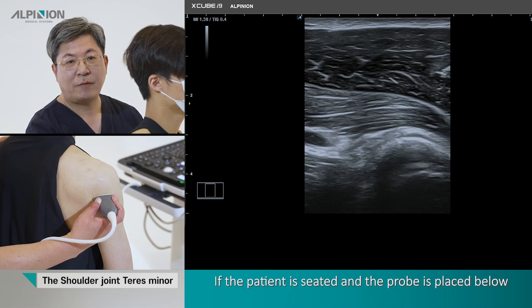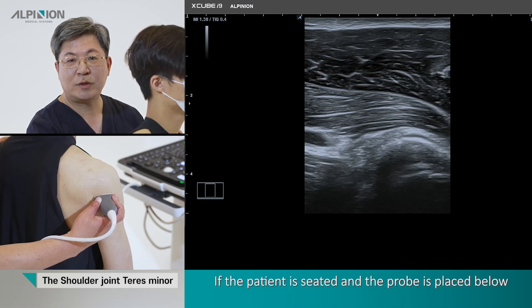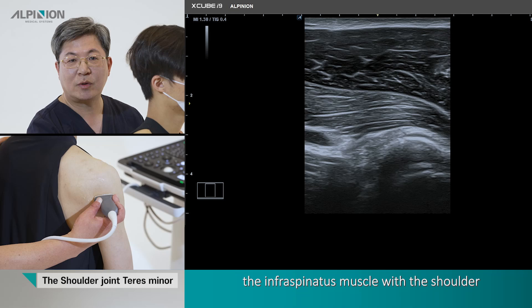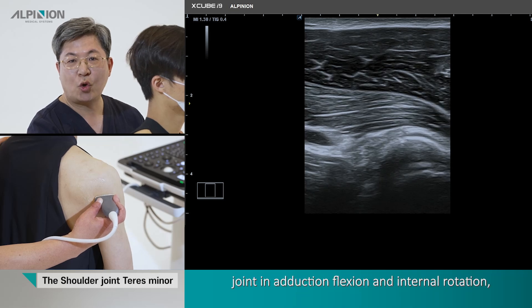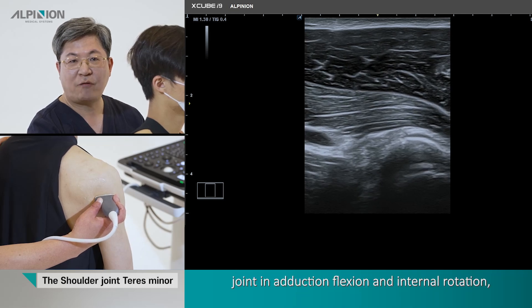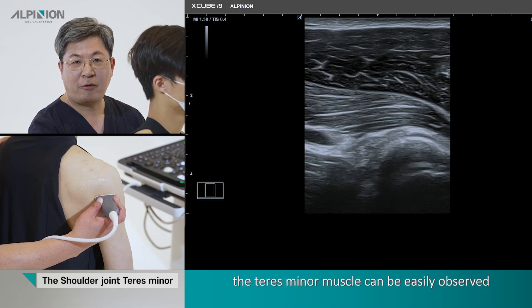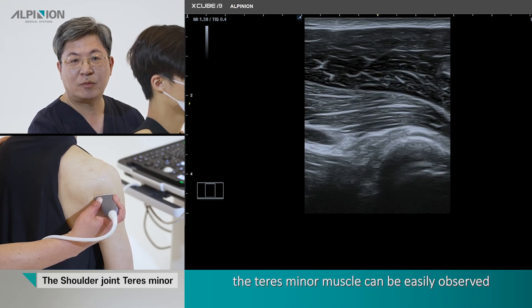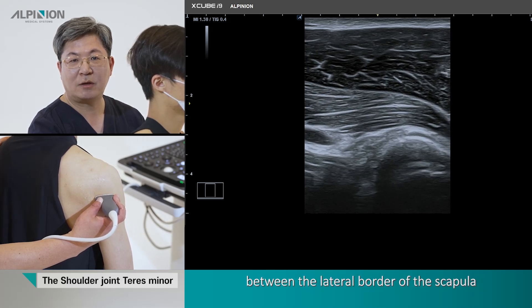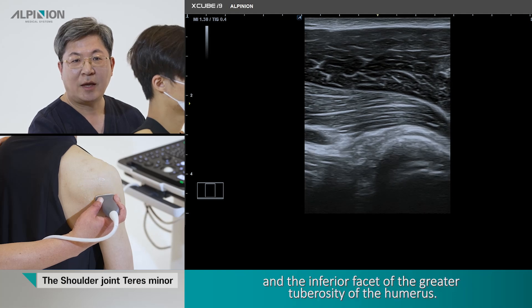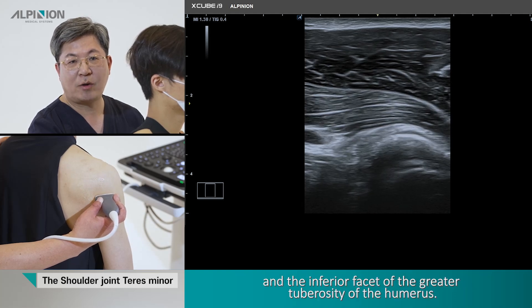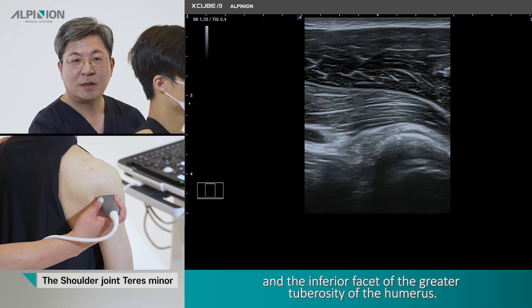With the patient seated and the probe placed below the infraspinatus muscle, with the shoulder joint in adduction, flexion, and internal rotation, the teres minor muscle can be easily observed between the lateral border of the scapula and the inferior facet of the greater tuberosity of the humerus.